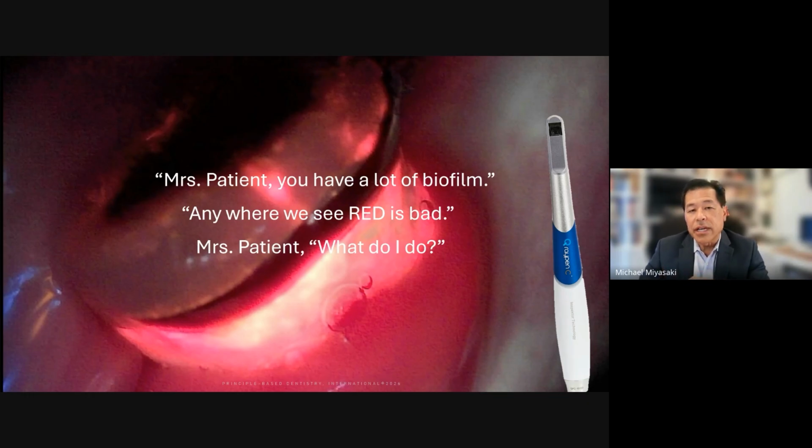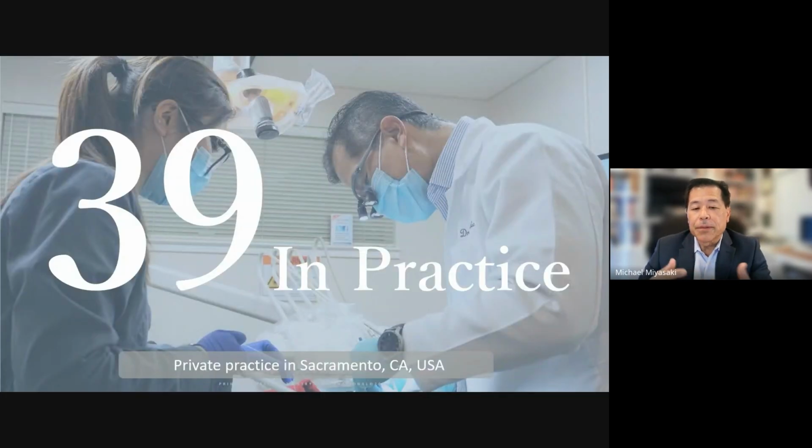And now we use this technology and we show the patient and explain to them that wherever you see red is bad. The patient looks at this image and it's glowing red. What I'd want you to think about is, would that motivate you to do something?